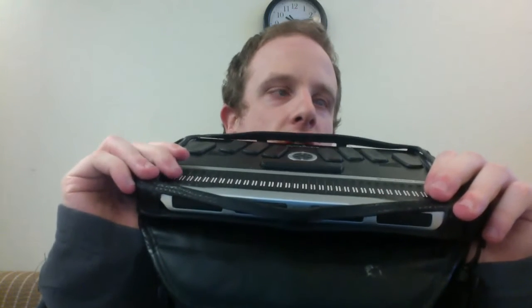This display, you might be thinking to yourself, is much bigger. Hold on. Let me grab it again. Much bigger than the other one. You got this one, and you have this one. This one, the refresher Braille, is 18 cells. So I can only read 18 cells of text. The Braille Note is 32 cells.